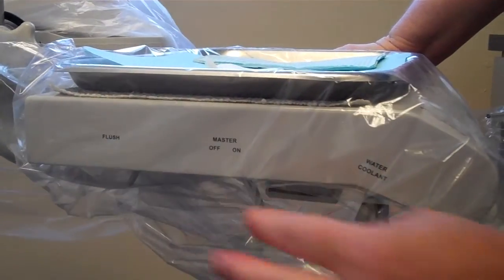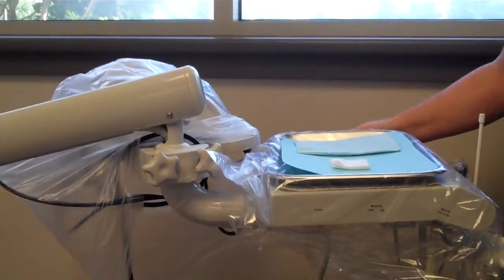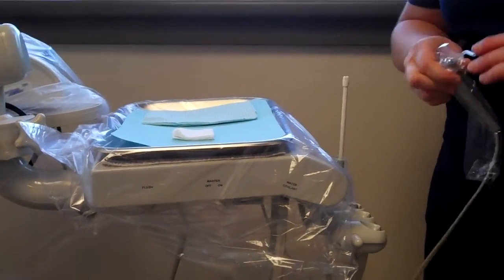And then you'll turn on your unit. Make sure the switch is on. Bring the tray delivery system over to next to the window. You'll take your air and water syringe.